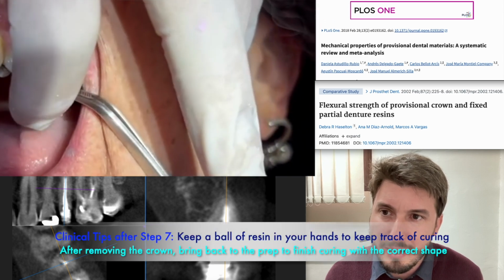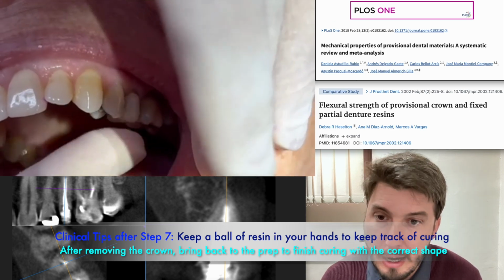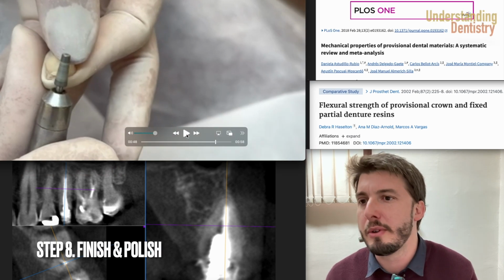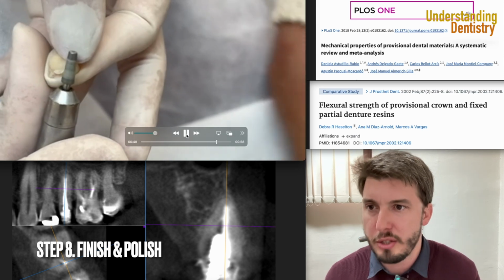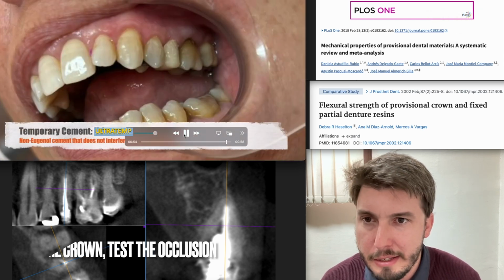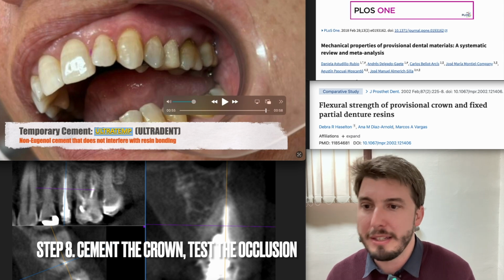But then when you have some consistency, then you're going to remove the crown from the alginate impression. And then, of course, after it gets completely polymerized, then you're going to do the polishing and the finishing. Okay, so you're going to do the polishing because there will be some excessive parts of resin. All right. And then you are going to cement this crown, right? So you are going to cement this crown.